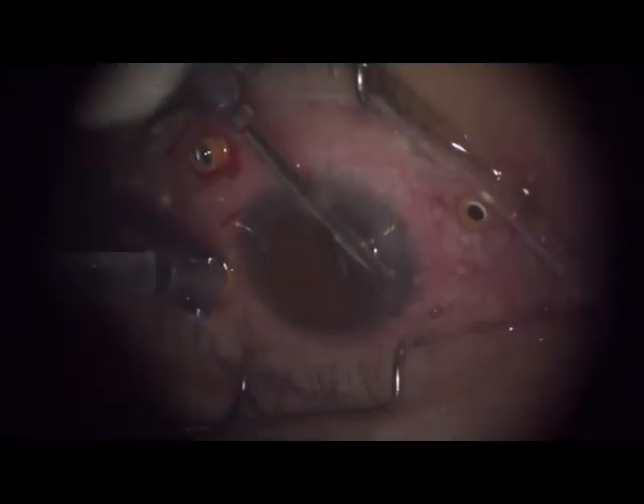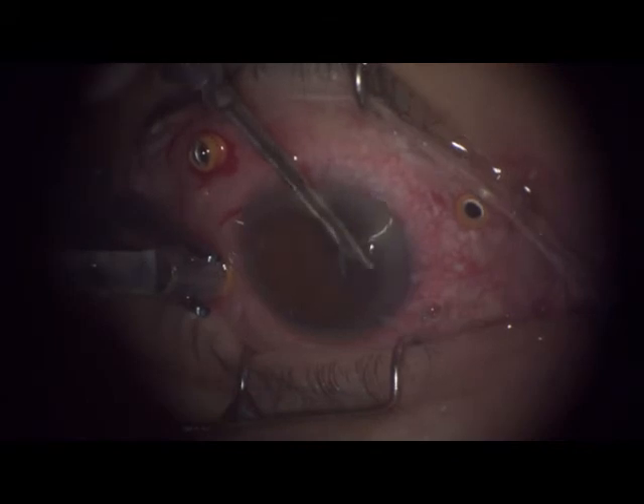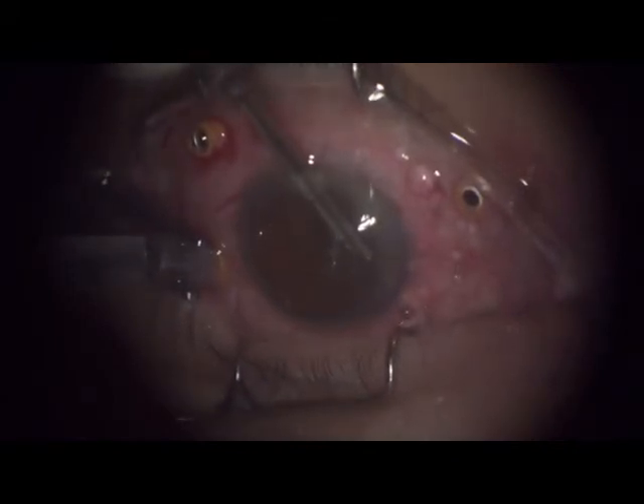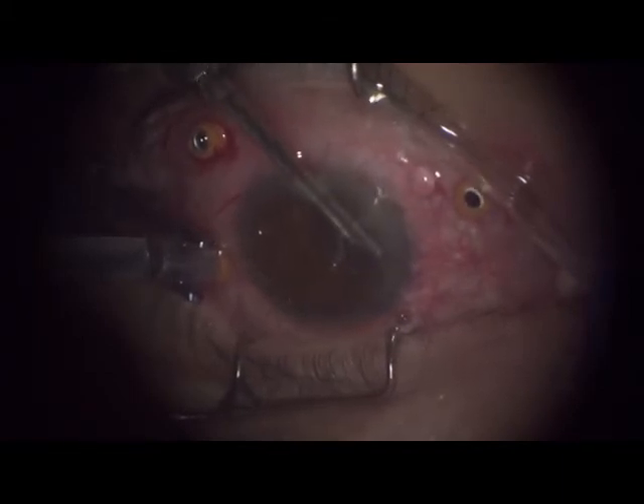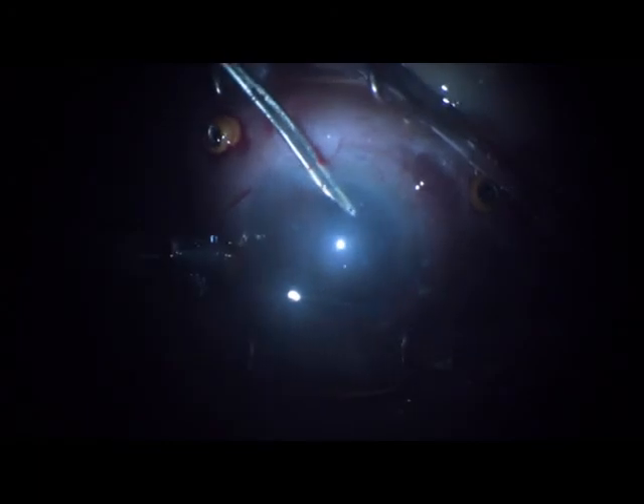You can see there is no slippage — the retina is fully attached and the oil grabs the drops from the retinal periphery. We don't leave the eye with any PFO. We remove the last drop, and some silicone oil that may have come to the anterior segment is also removed. Even though the pupil is small, you still have a very good view from the posterior pole. Thank you very much.